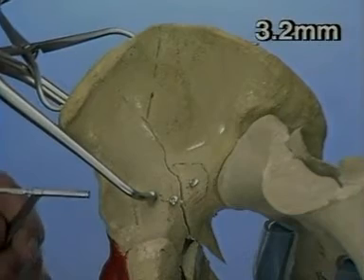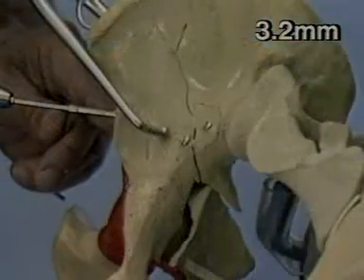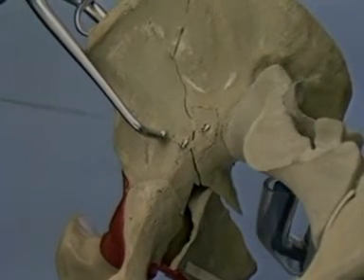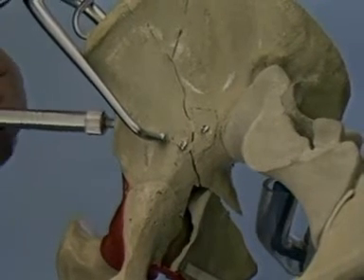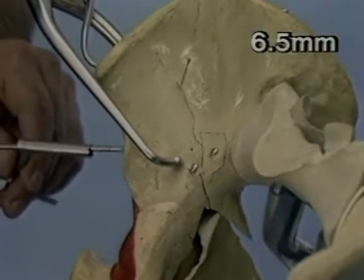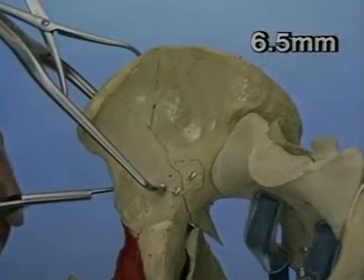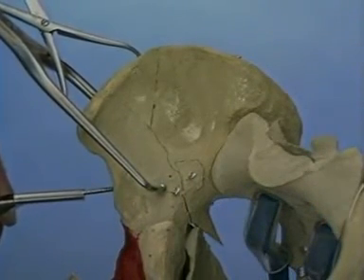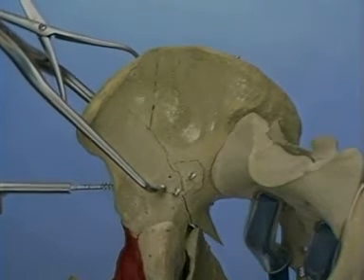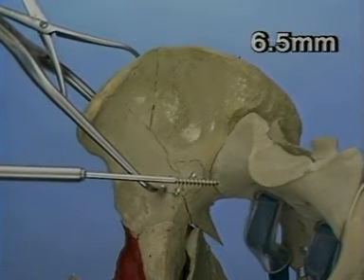A long 6.5 millimeter screw will be started just lateral to the anterior inferior spine and directed just above the greater sciatic notch. The 3.2 millimeter drill bit is used. The depth is measured and the 6.5 millimeter tap used. The 32 millimeter thread 6.5 millimeter screw is inserted.